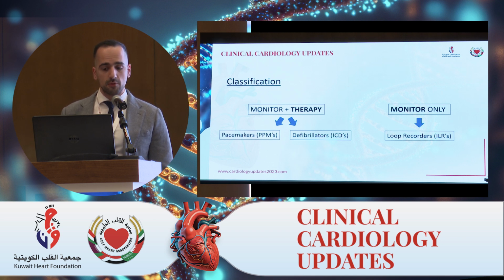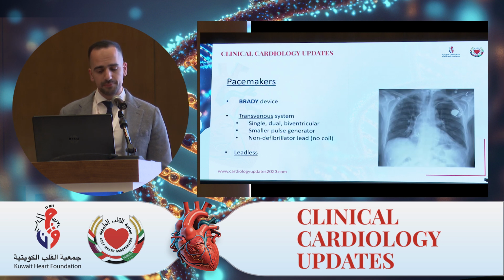The best way to approach these devices is to simplify and classify them by what they do. You have those devices that simply monitor, which are your loop recorders, and those that can monitor as well as administer therapy. Those are either pacemakers or defibrillators. Pacemakers are best thought of as Brady devices. These are devices we implant to treat bradyarrhythmias.